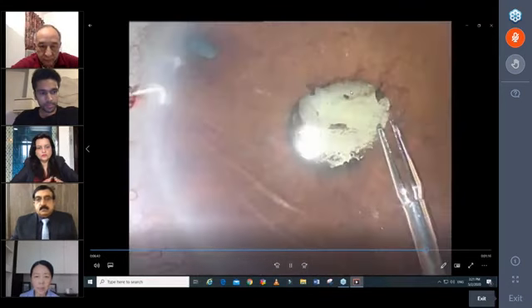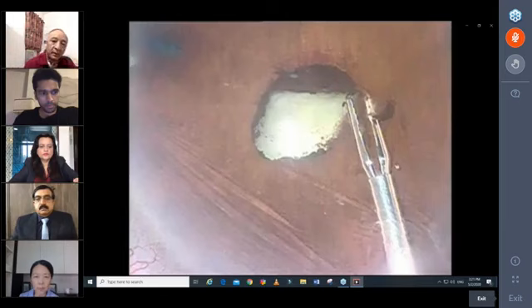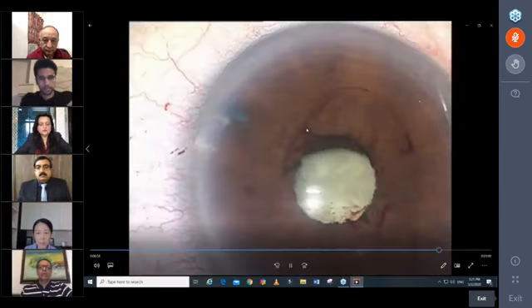So this again is a really small pupil, and I like to zoom up to high magnification so I can see what I'm pulling. Whoops, I pulled a bit too much, and that was a posterior pigmented leaf. All right, so be very careful.